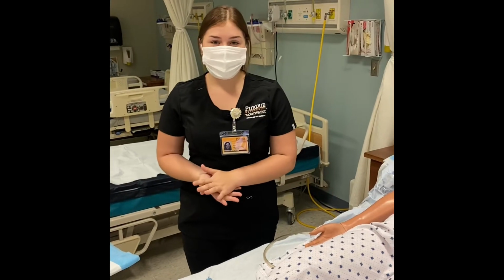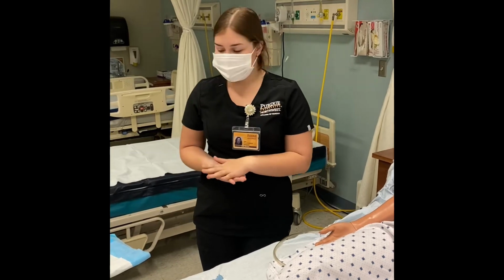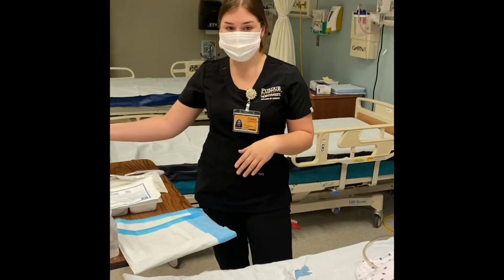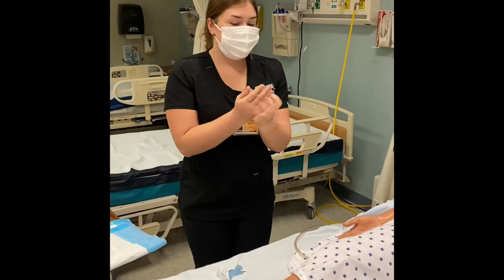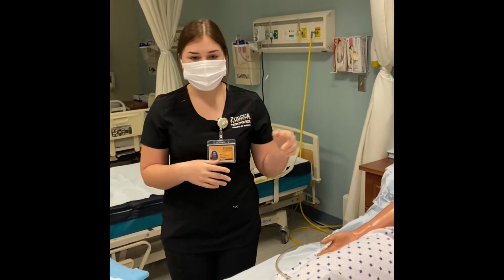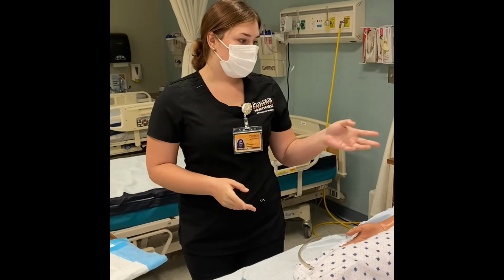Hi, my name is Haley and I'm going to be demonstrating trach suction and care today. So the first thing I'm going to do is gather my equipment up on a bedside table and perform hand hygiene. Then I'm going to identify my patient and make sure that I provide privacy for the patient. And then I'm going to describe the procedure to the patient, what I'm going to be doing.